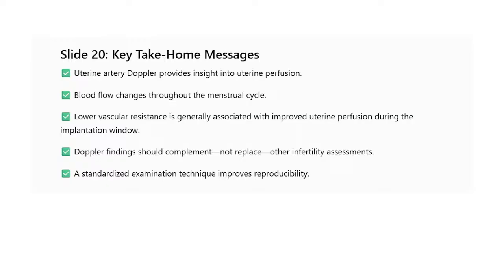So, I have said a lot. You should internalize these things and master these things. What are your take-home messages today? Uterine artery Doppler provides insight into uterine perfusion.